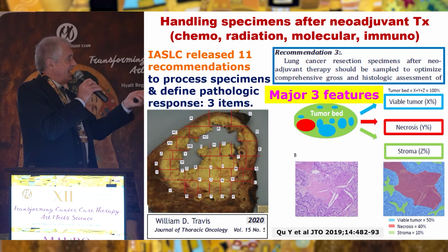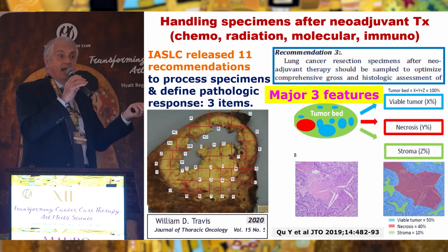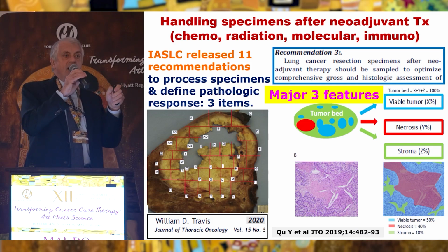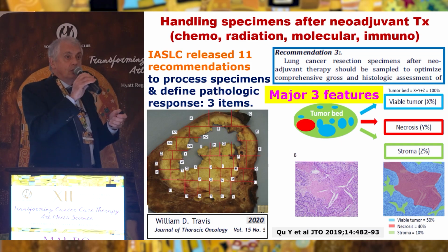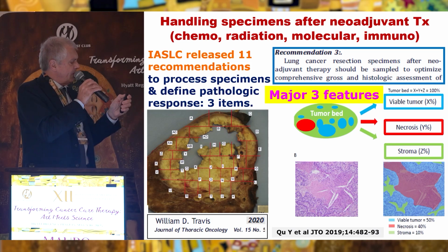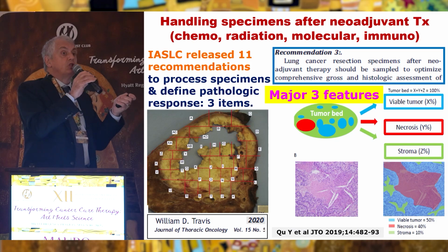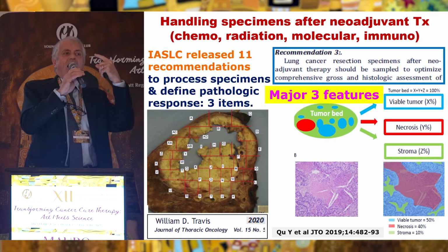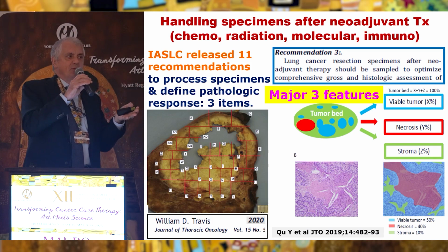So this is the real life on the left part. This is a tumor with a central cystic excavation, many blocks, many slides. We have to make a percentage of the viable tumor cells versus the non-viable tumor area, summarizing this colored graph here, in which you have the so-called tumor bed, which is the idea of where the tumor was before the very effective treatment you gave.